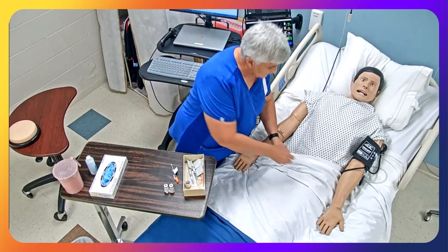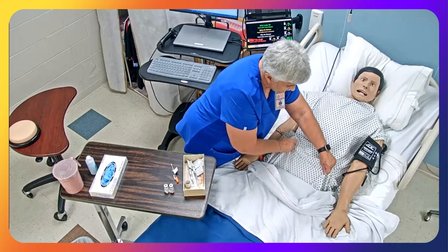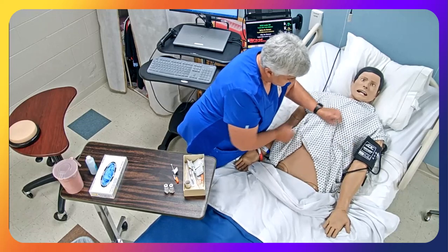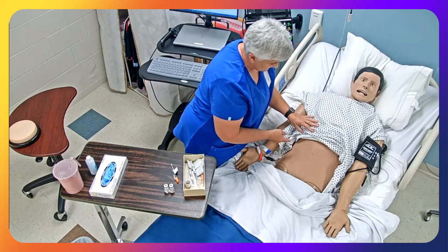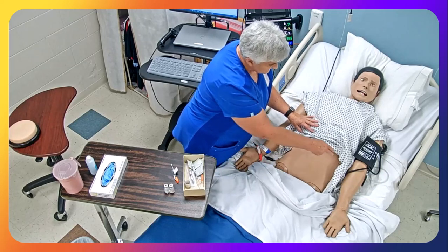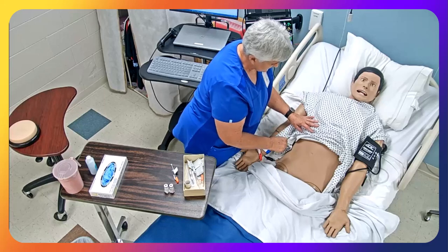We can also give it in your abdomen, and so we've provided for privacy. Now, where do you give your insulin at home? You give it in your abdomen? Okay, so just remember that you've got 4 different quadrants. Your belly button, and you're going to draw an imaginary line. So you've got spots in each one of these. You just want to stay about 2 inches away from the umbilicus, okay?